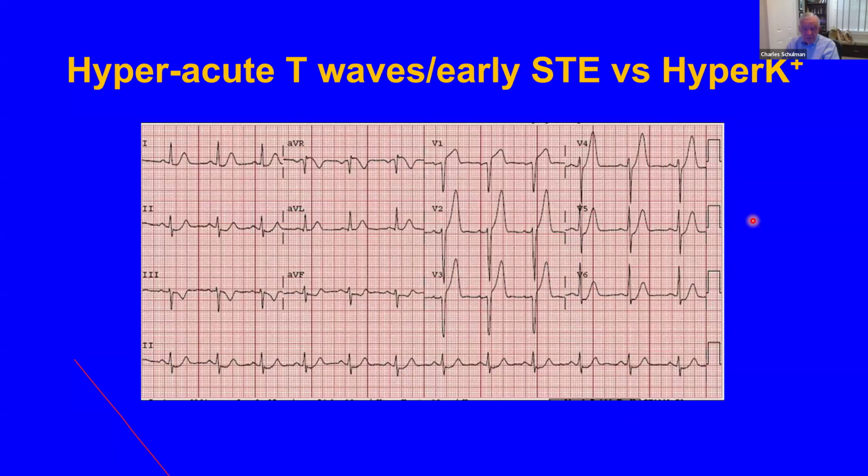Okay, so here we have some very tall T waves noticed here. Okay, are these hyperacute T waves associated with early ST elevation MI, or are these hyperkalemic?